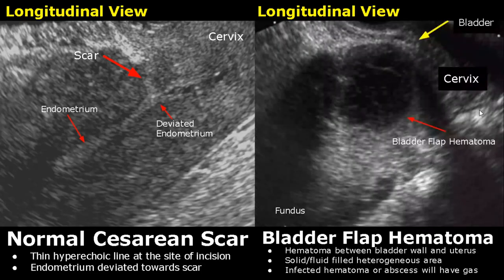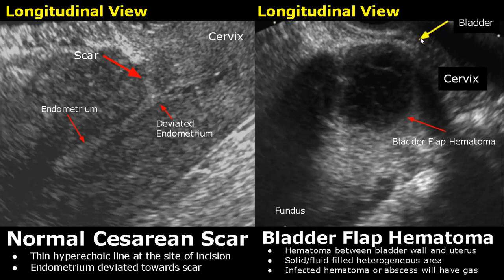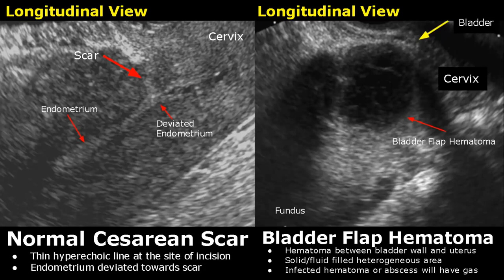A bladder flap hematoma refers to a collection of blood between the bladder wall and uterus, which can occur after a C-section. The bladder is present here, anterior to the uterus. This hematoma will be heterogeneous with solid and fluid-filled areas. If it gets infected, gas will be seen. We will see dirty grey posterior shadowing in case of gas.